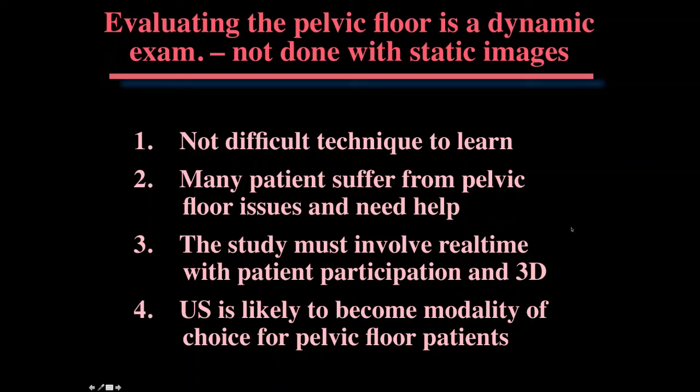So let's see, have standard orientation guidelines been established for the transperineal translabial scanning? I don't know that the actual guidelines have been established for pelvic floor. I think that we have some guidelines for pelvic floor that are probably available, but I don't think anybody uses them. We certainly don't have accreditation for it right now, and it's certainly something that definitely needs work.